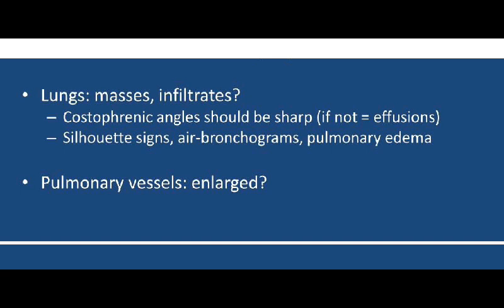Air bronchogram is when the bronchioles that are meant to appear lucent are now appearing opaque, due to displacement of air with all these infiltrates, fluid, or edematous fluid and the rest. The air in the bronchioles is displaced because of pathology, and there are various pathologies that can cause it to start appearing opaque. Then we have pulmonary edema, that is also edematous fluid in the lungs.